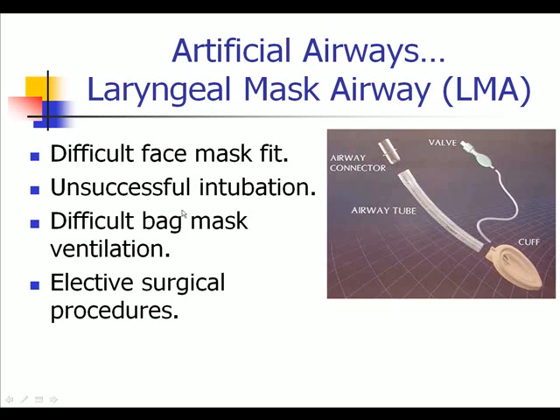There are some additional items here. It could be because the face mask is difficult to fit, unsuccessful. If they cannot intubate somebody, they may emergency try the LMA instead. Difficult for bag mask ventilation. It may be much easier to place the LMA than to try to ventilate somebody with a mask. And again, for elective surgical procedures, that's typically a common use of the LMA.